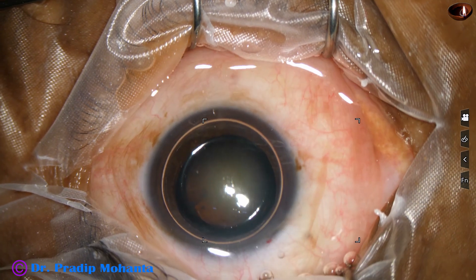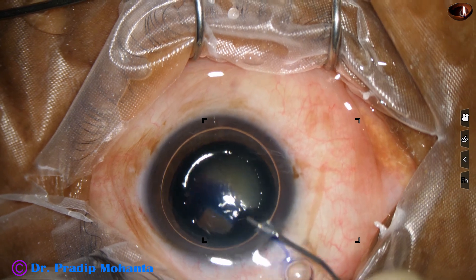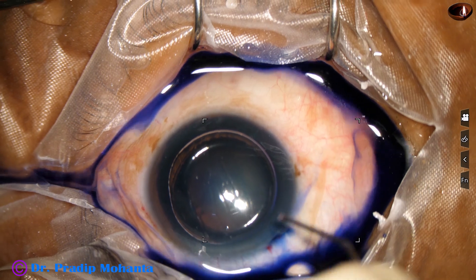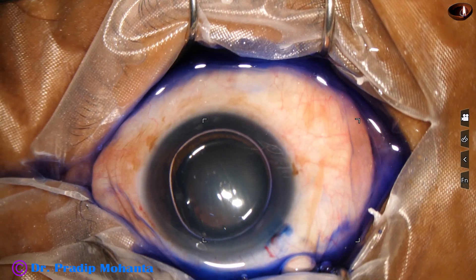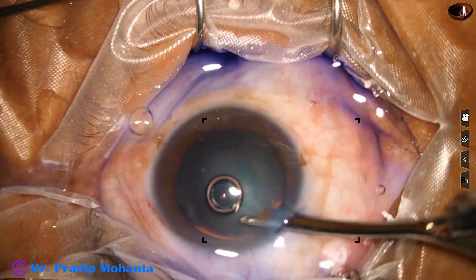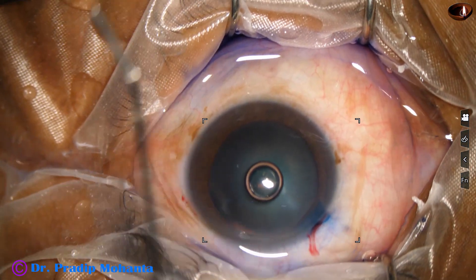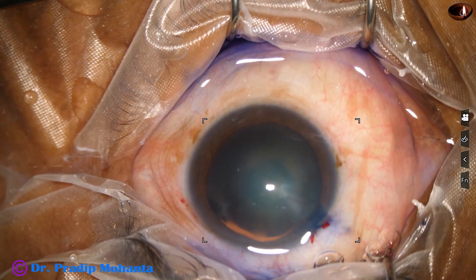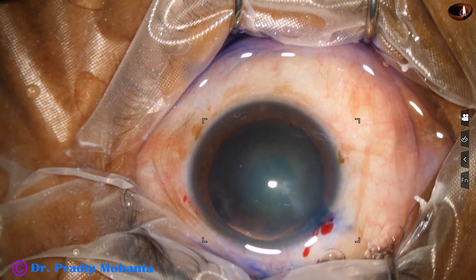I inject an air bubble and beneath this air bubble trypan blue dye is applied over the anterior capsule. A bit of adrenaline is injected and the dye is washed out with a Simcoe cannula — it becomes a nice job if we clean the dye out. Now the anterior chamber is filled with Viscoat.